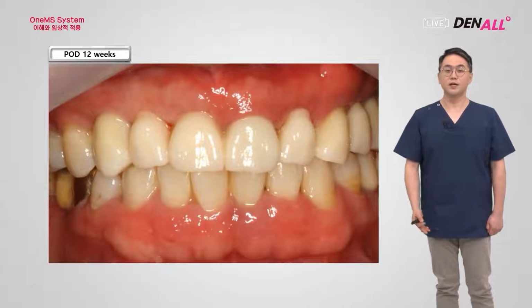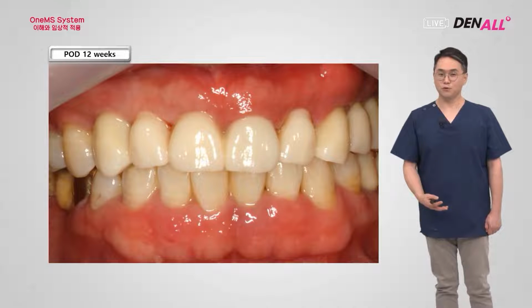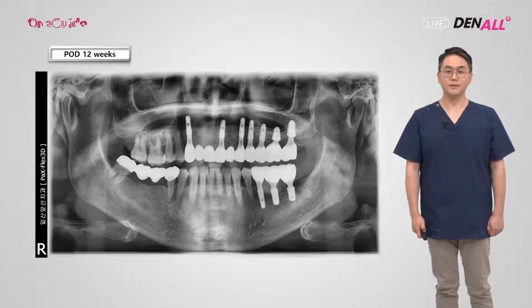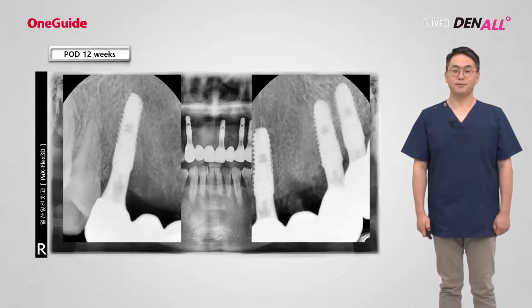And to place the implant, I did not use a blade or do any suturing because the flap was not opened, and that is the strength of the guided surgery system. This is after delivering the final prosthesis.